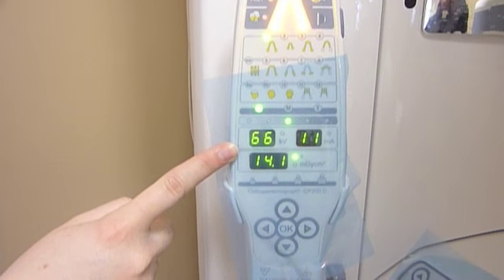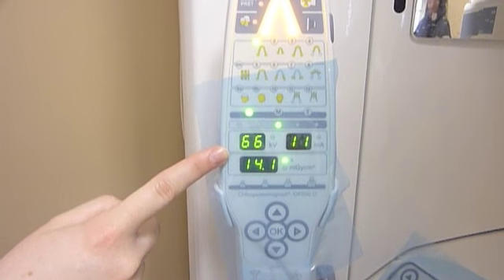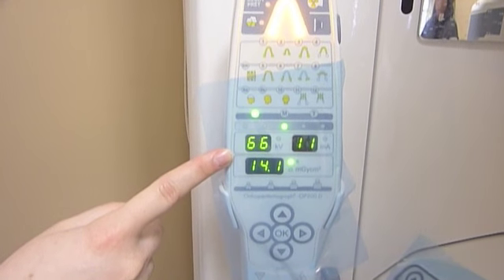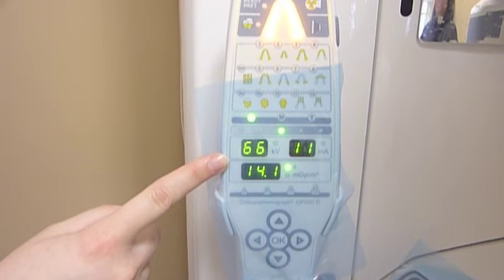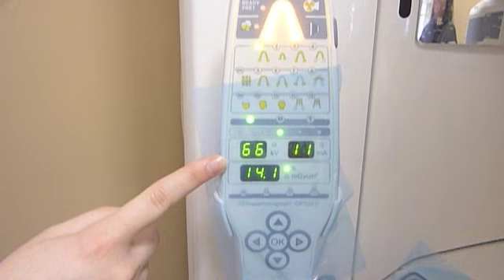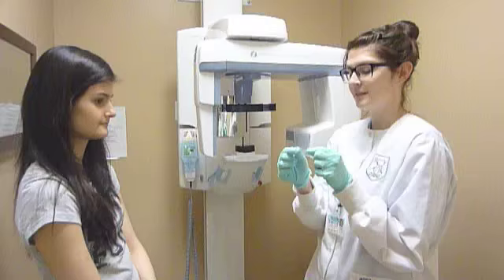Before getting the patient, make sure that all of your settings are correct. You can use the arrows and the OK button to adjust the settings. In this case, we're going to be using the adult setting, which is setting number 2. Alright, Diana, the panoramic room is all ready.